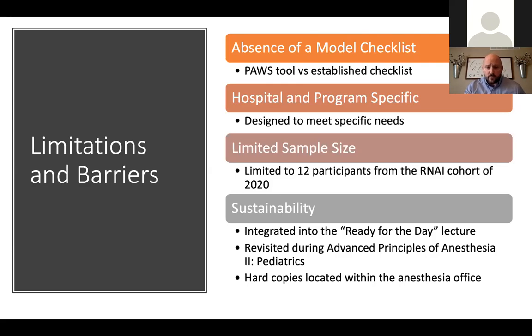The PAWS tool will then again be revisited during Advanced Principles of Anesthesia 2, specifically lectures regarding pediatrics, where interns are provided in-depth education related to delivery of pediatric anesthesia. And finally, hard copies will be printed and located within the anesthesia office to provide interns with easy access to this tool on a day-to-day basis.